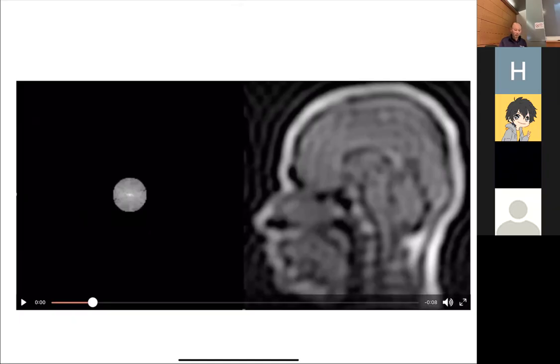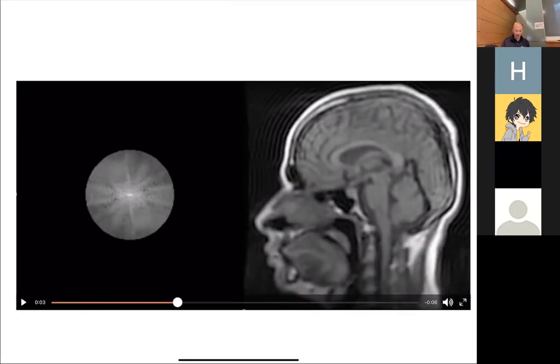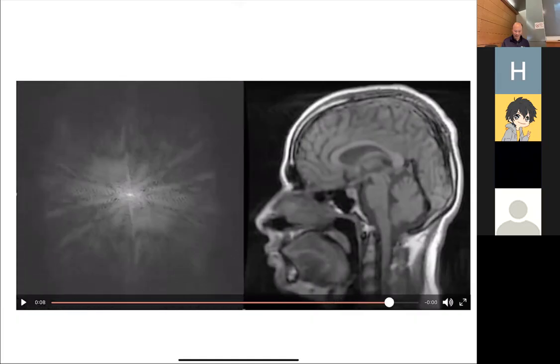But if you had something wrong with your brain, you wouldn't want the doctor to make a diagnosis on this image, right? You're not like, ah, yeah, that's good enough, let's go ahead with the surgery, I sort of know where the tumor is. No, you would want them to keep scanning and get more and more K-space so they know exactly where the tumor is. So that's the trade-off we're going to be talking about: how much of K-space do we actually need to acquire?